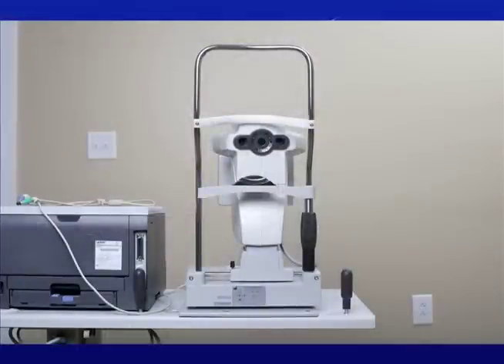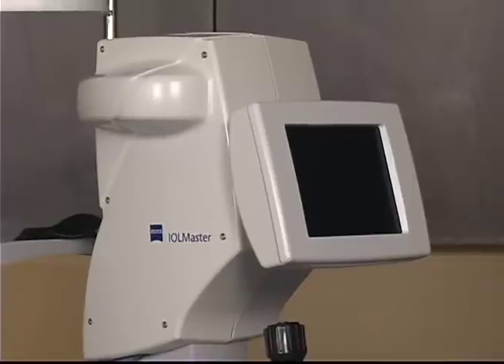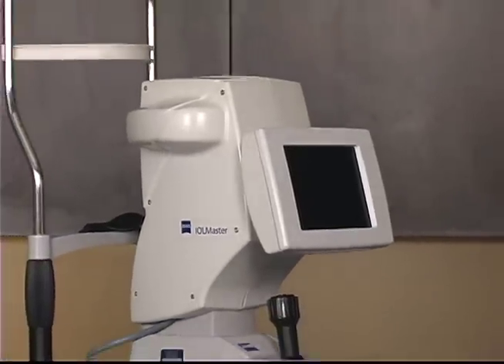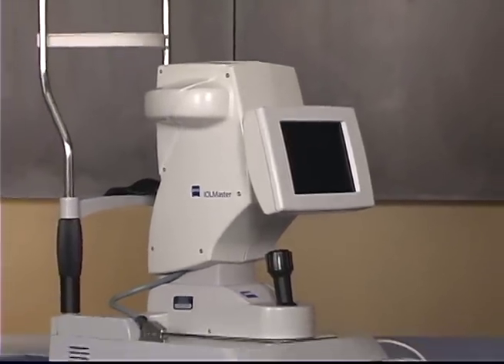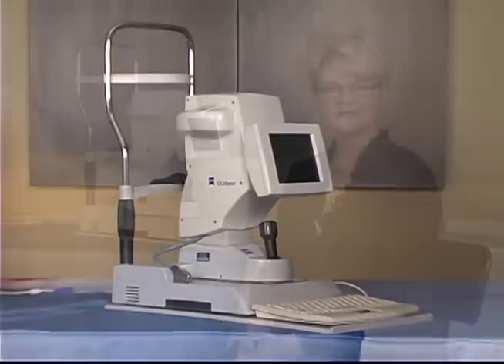The IOL Master will also measure the anterior chamber depth and the horizontal corneal diameter, with a wide range of IOL calculation options for the surgeon and an optimization function which automatically calculates the individual lens constants. The IOL Master provides highly precise measuring data as a basis for optimum visual outcomes.